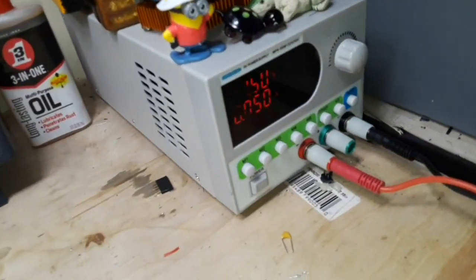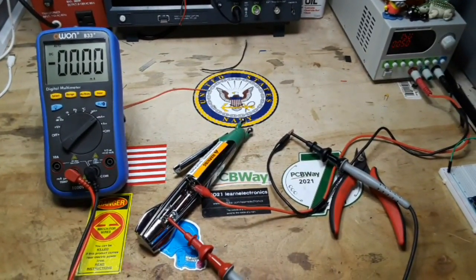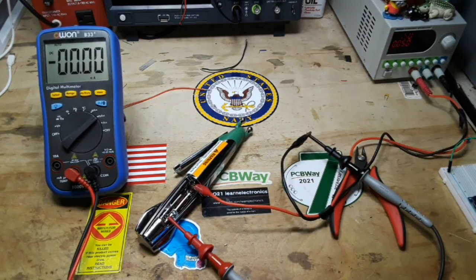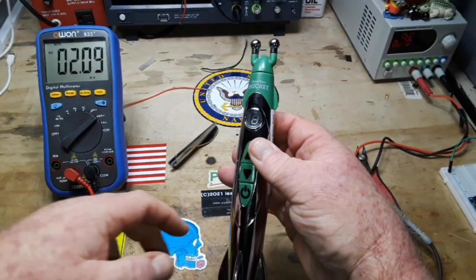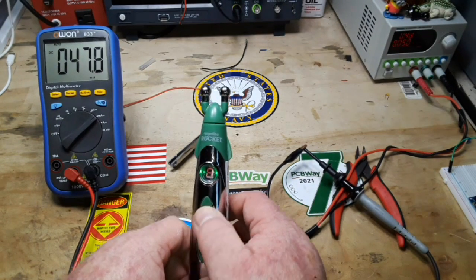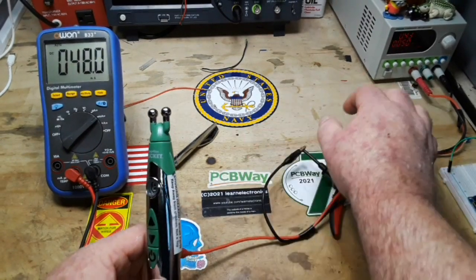So we've got the power supply set up for a volt and a half, 50 milliamps, which is about the max you want out of a double-A battery. The positive from the battery going to the positive of the thing, the negative of the thing goes through the ammeter and back to the power supply. We'll power it up. It's not even turned on and it's pulling two milliamps. Turn it on. Two milliamps. We might need more current here.